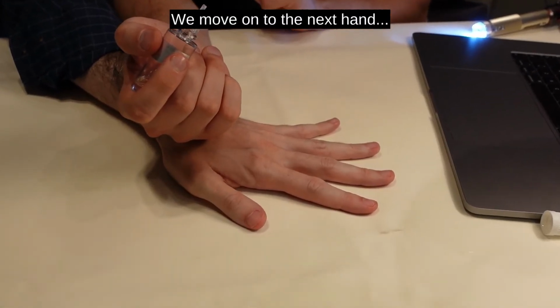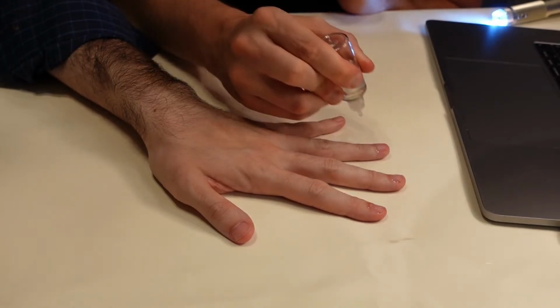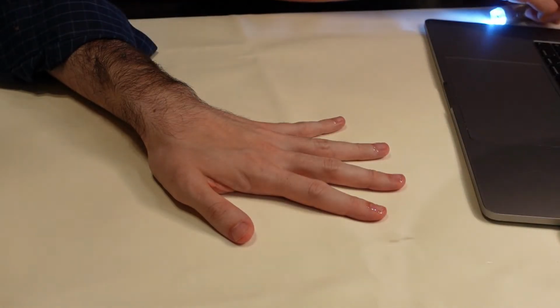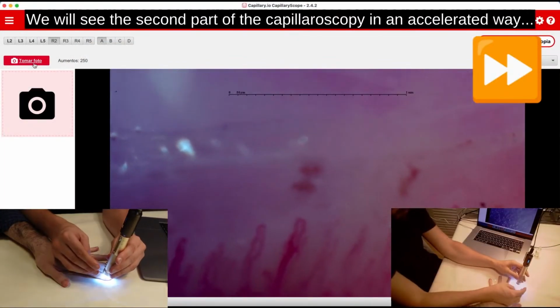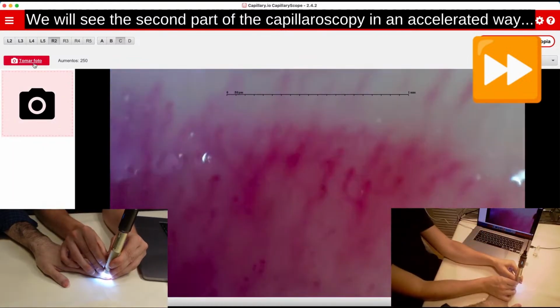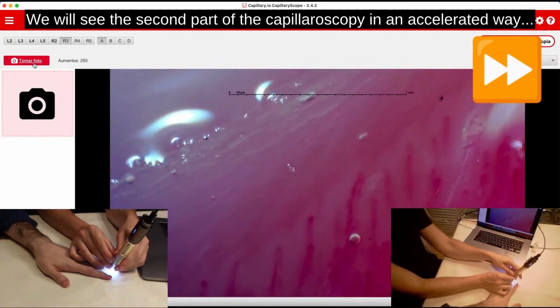Next, we will do the same process for the second hand, and of course the first thing to apply is the immersion oil. I like this oil because it's somewhat dense and it will be on the finger for some time, so I don't have to reapply the oil that often and am able to take the pictures in a faster way. For this second hand we will do the same process, so we are going to watch it in fast forward. You still will be able to see each picture.